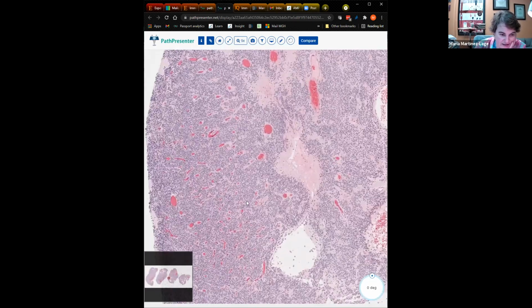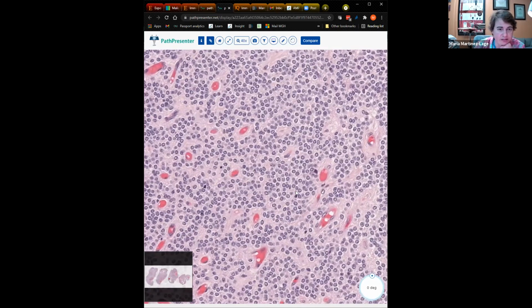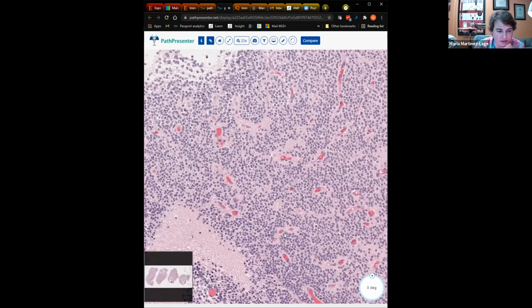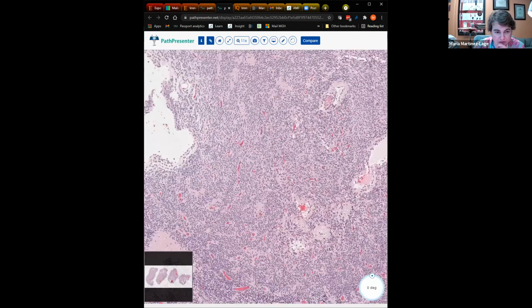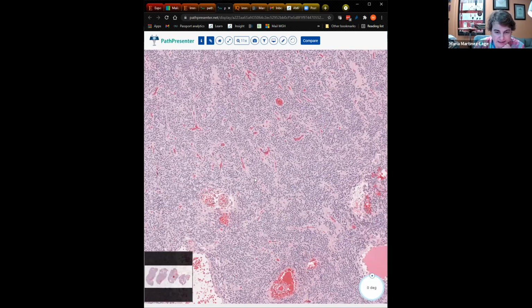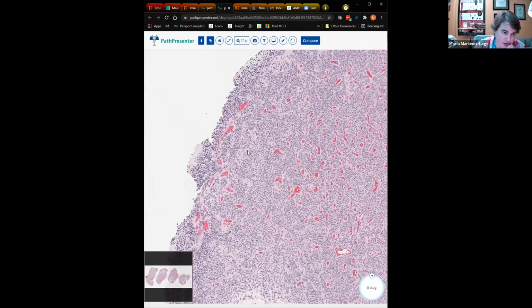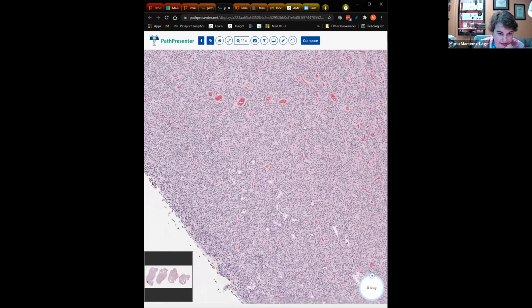So central neurocytoma is typically seen adjacent to the ventricles. And then extraventricular neurocytoma is the other designation of these tumors. These are, again, low-grade tumors with a low rate of recurrence as well. They will typically have synaptophysin expression throughout the tumor and not very much in terms of GFAP. They tend to be well circumscribed, similarly to other lesions we've talked about that are low grade. And they can actually be almost entirely intraventricular, depending on the growth pattern.